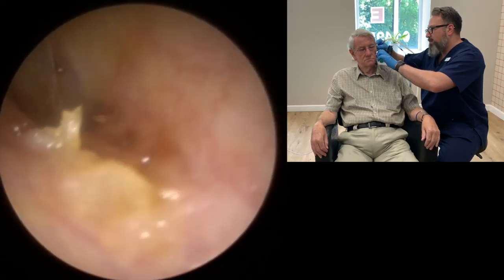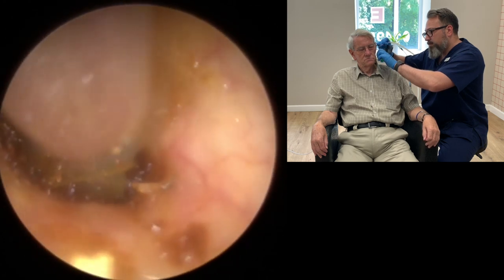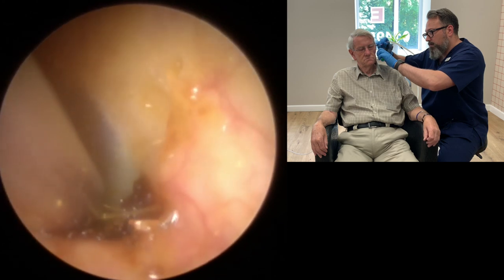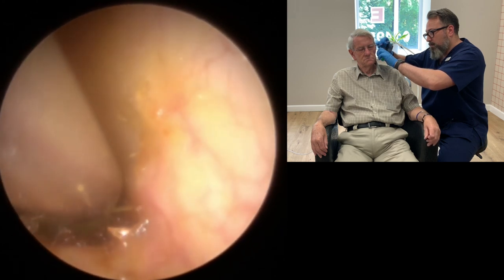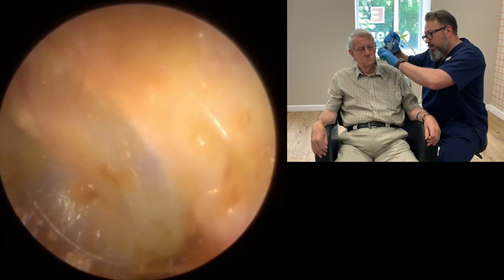So we've managed to clear the offending wax. It's not gonna cause any issue, you know, as far as the hearing's concerned. We're just gonna see how easy it is to take these couple of little soft pieces away just on the ridge here. I mean, it's not causing any issues as far as hearing's concerned, but we'll just take the top end off that. Here we are, sir.